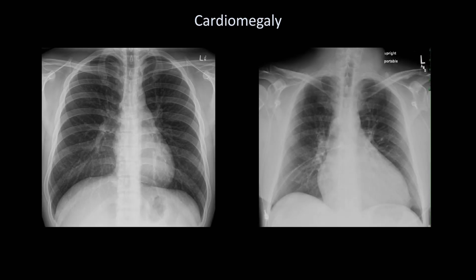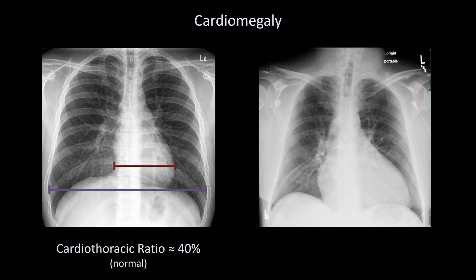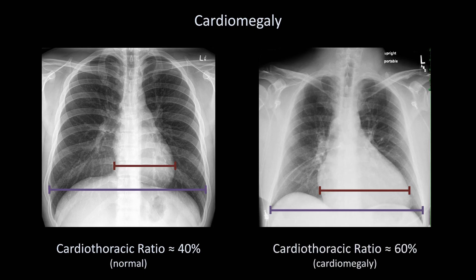Here are two x-rays. Looking at the one on the left, the red line represents the maximum horizontal cardiac width and the purple line represents the maximal horizontal thoracic width. This is a ratio of 40% or 0.4, which is normal. Looking at the right film, the heart is obviously much larger — this is a ratio of 60% or 0.6. Identifying cardiomegaly on x-ray is really that simple.